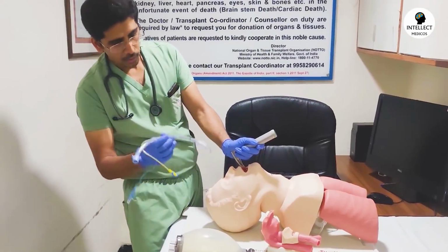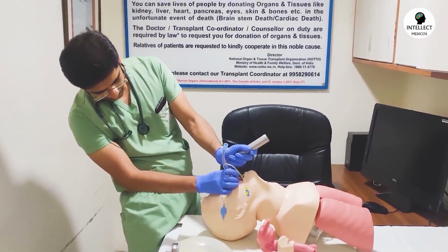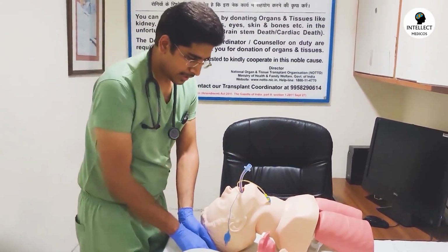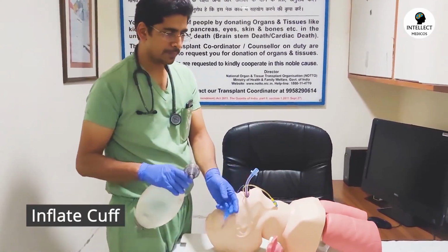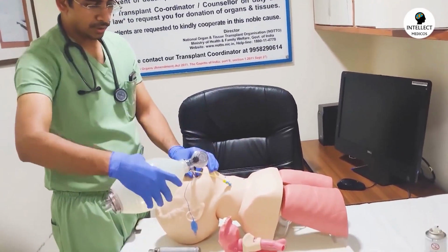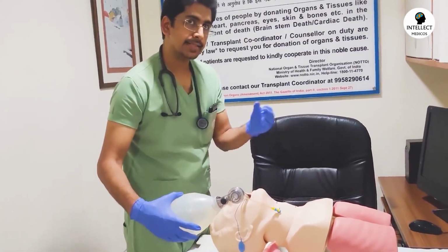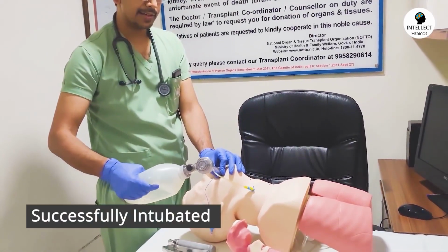And with the other hand holding the endotracheal tube after lubricating in this manner, I'll go inside, and yeah, I can see, and I have inserted the endotracheal tube till that black mark which I discussed. Now after this, we need to inflate the cuff of the endotracheal tube and attach the resuscitation bag. You should hold the endotracheal tube from the angle of the mouth, from this point, so that it doesn't slide inside. Now, yeah, so we can ventilate the patient.